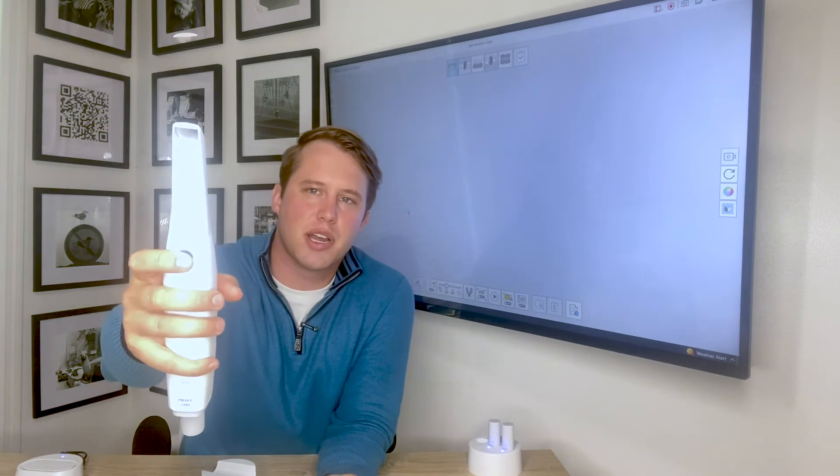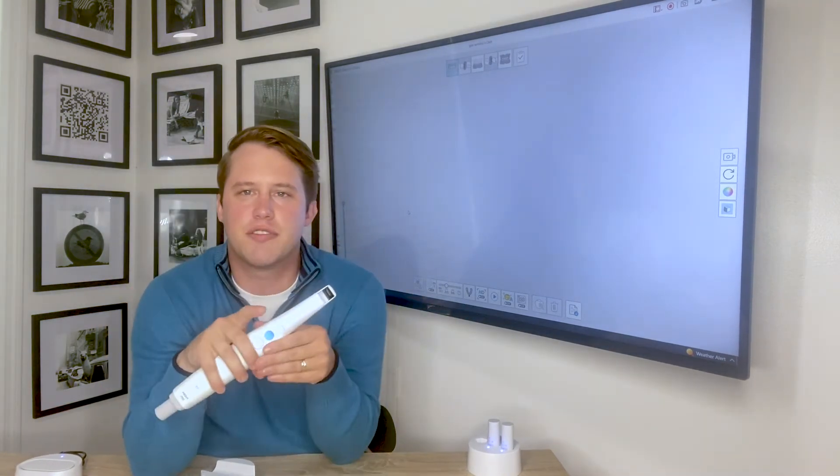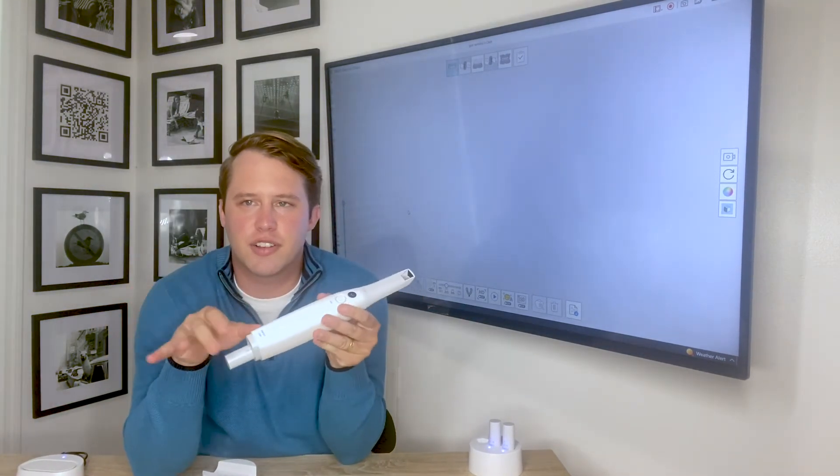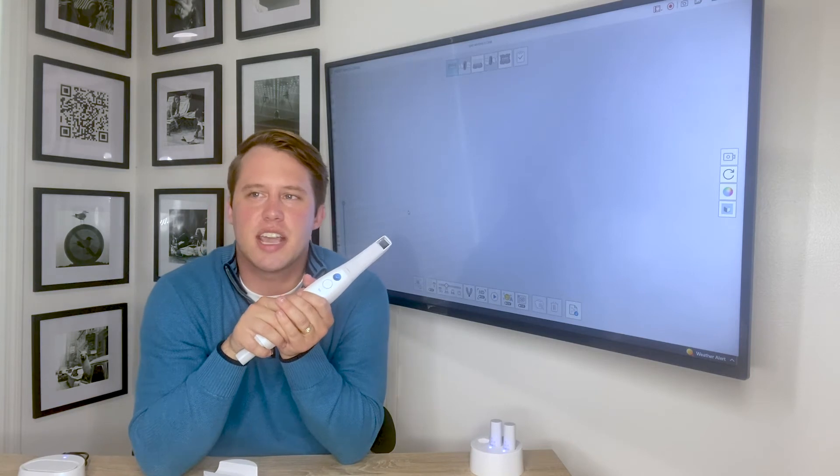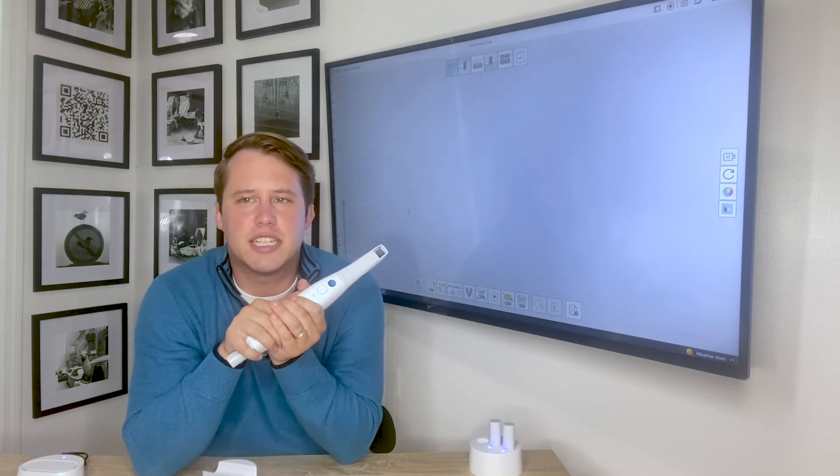When we want to start scanning, press the blue button. I should mention though, if this is your first scanner or you don't have a lot of experience using digital scanners, fear not.